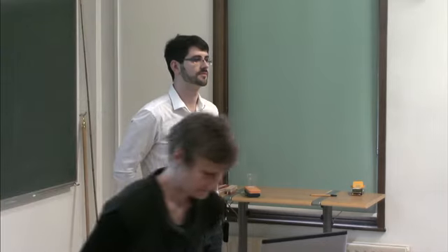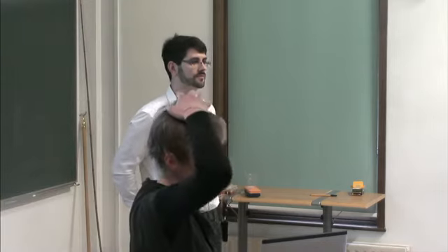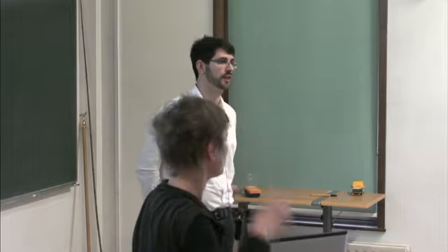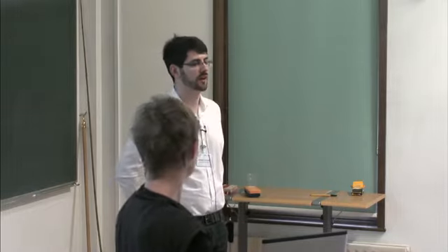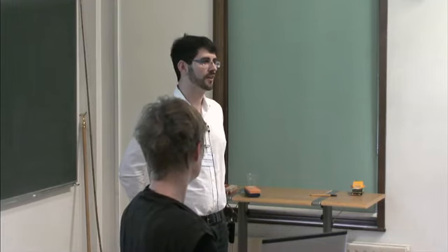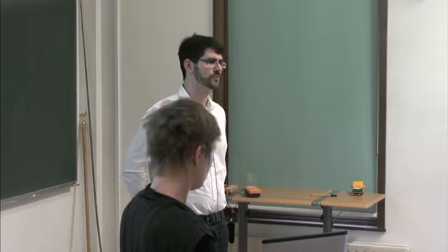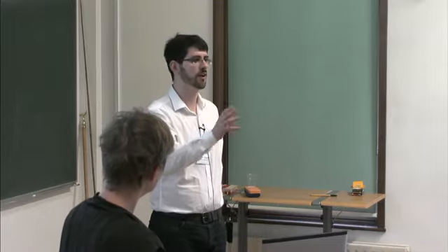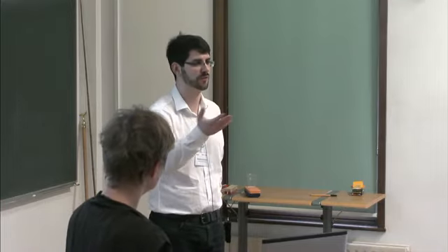Yes, please. The fundamental problem in PET-MR is attenuation correction. I didn't hear any mention of that. That's true. If you want to do attenuation correction, that will probably be based on the MR. Then if you want to reconstruct the MR using PET, but want to reconstruct the PET using the attenuation from MR, obviously this results in a problem. One needs to find a way around it.